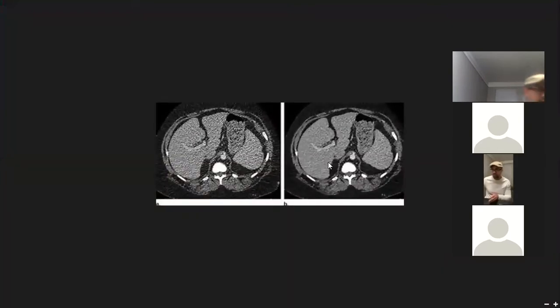Okay, so check this out. If we look here, we have a real image now, a real slice of the abdomen. We have image noise, like it's incredibly noisy here, and then we have a clearer image here, all right? So what I want you guys to understand is the difference here is going to be technical factors. And I'll connect the dots to slice thickness in a sec. The image on the right in this picture has a higher technique.